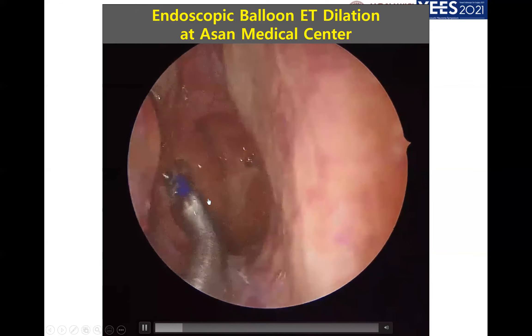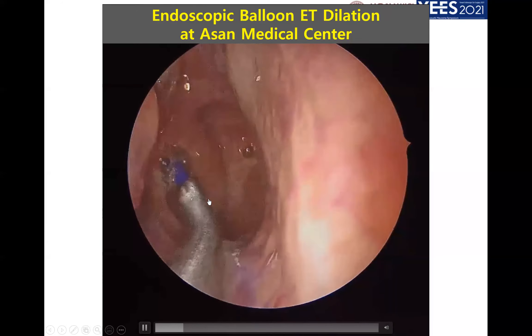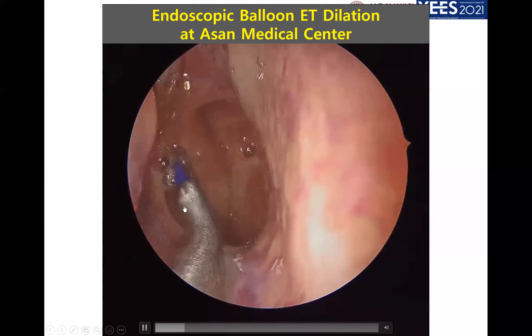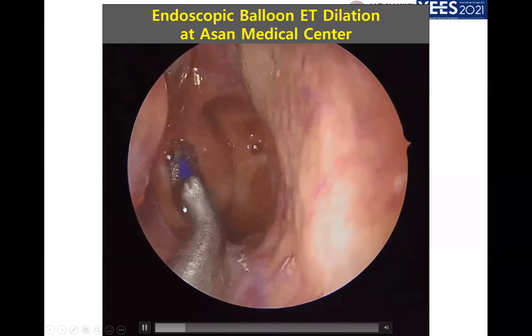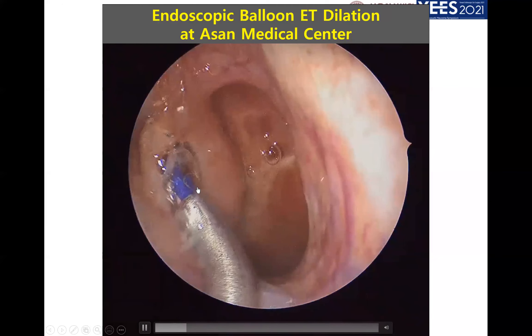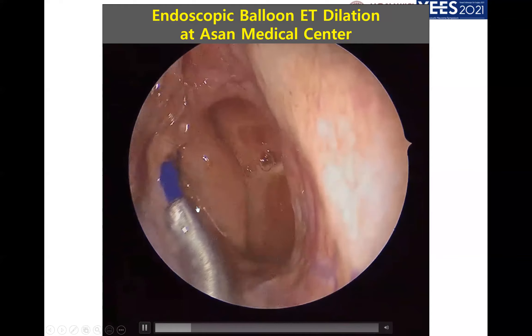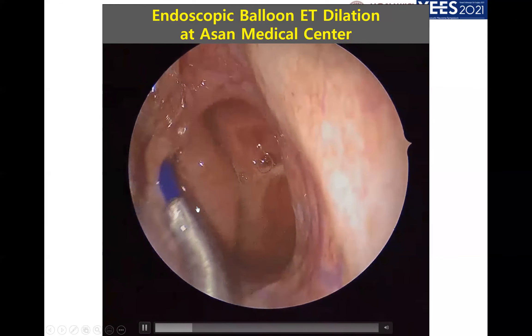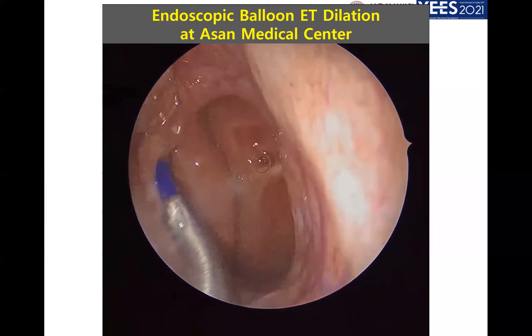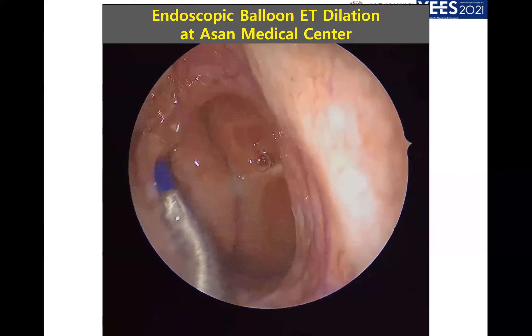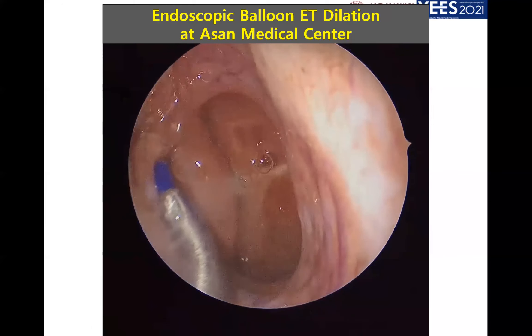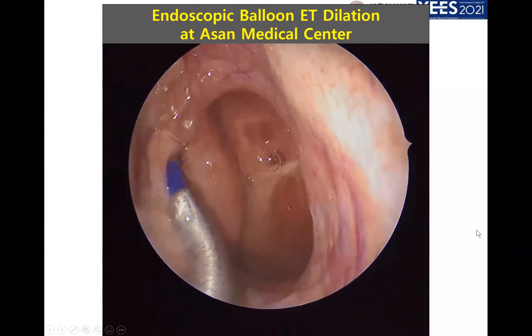Then you inflate the balloon and wait one minute, then deflate the catheter and put the balloon catheter deeper, and repeat the ballooning — inflating for another one minute — and then remove the balloon.